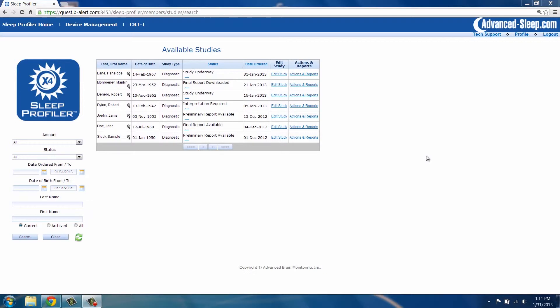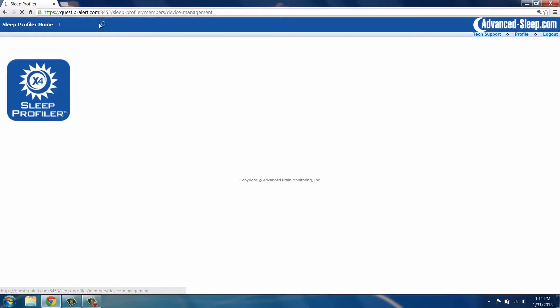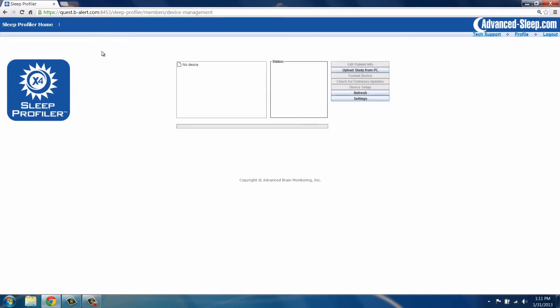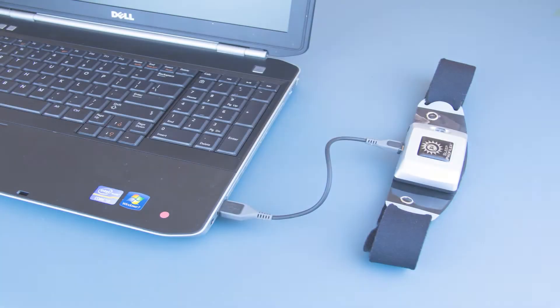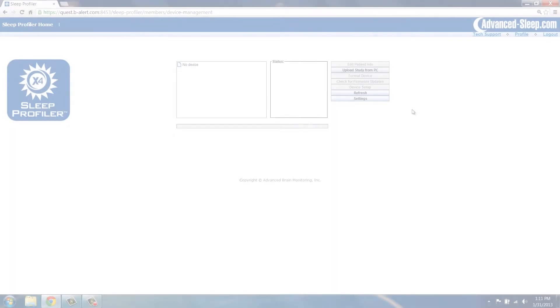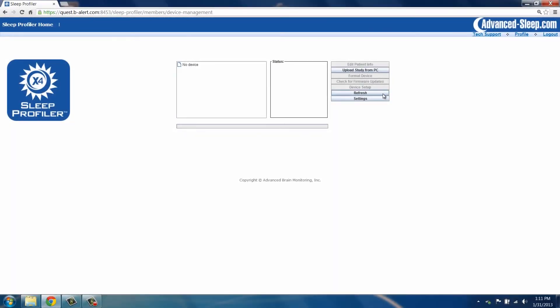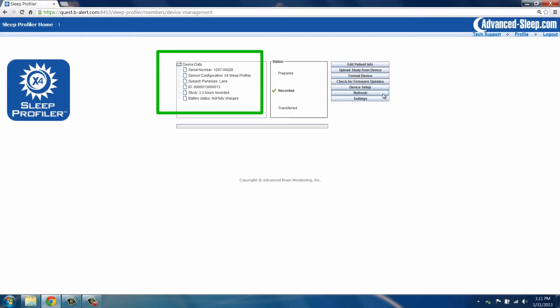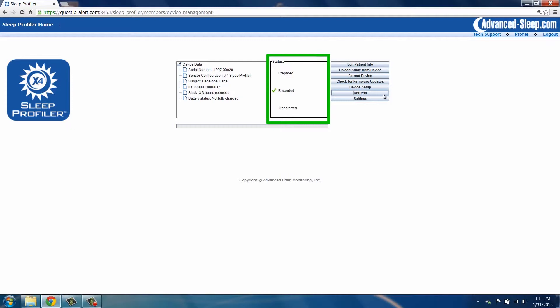To do this, on the Sleep Profiler home page, select the Device Management button. Connect the device to your computer using the micro-USB cable. Click the Refresh button. The device serial number will appear under Device Data.